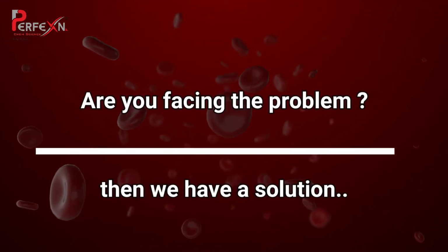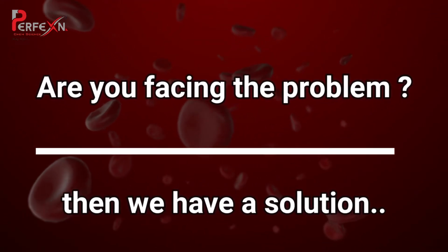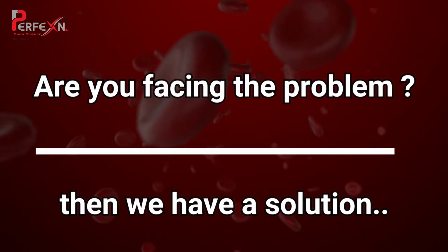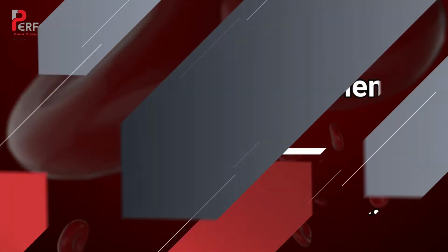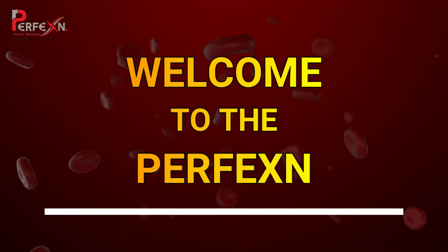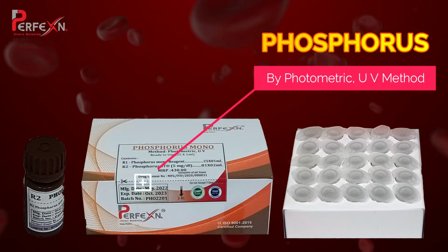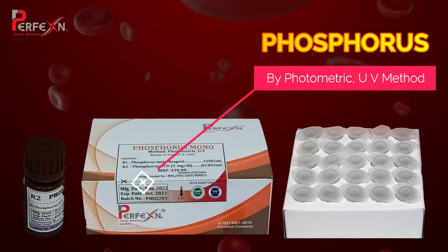Facing problems with kit settings in bioanalysis of a pathological laboratory? In this video, I will solve all your queries regarding kit setting. Hi guys, welcome to my YouTube channel. In this video, we will see how to set the phosphorus kit in the semi-bioanalyzer.